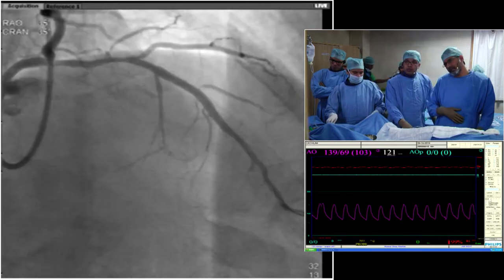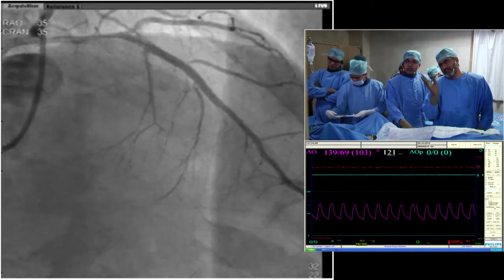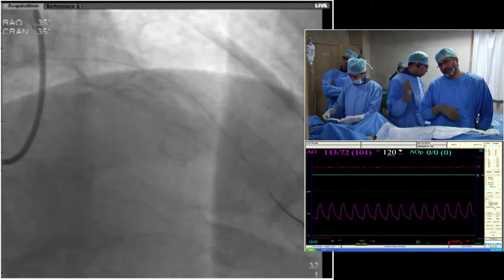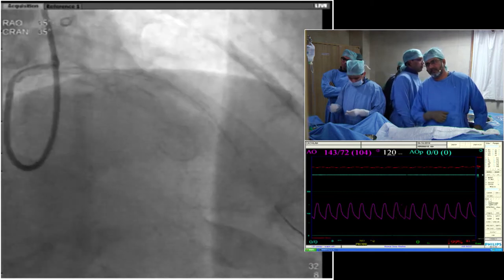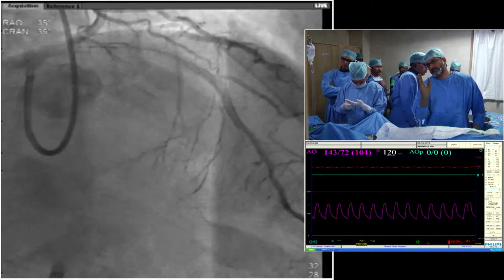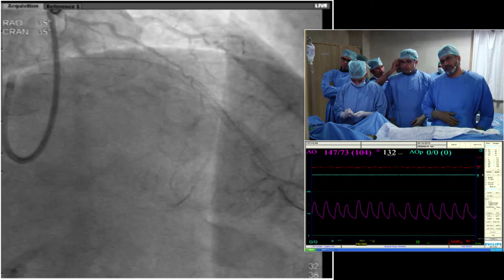Yeah, initially, that was the plan originally before we went ahead with the procedure, to cover it up to the mid LAD, up to the proximal LAD. But I found not much significant disease between the diagonal and septal, and I didn't want to compromise the diagonal, which is quite fair sized. So the reason is that maybe my stent doesn't extend up to the diagonal, and if I can land it there, probably I can get it out.